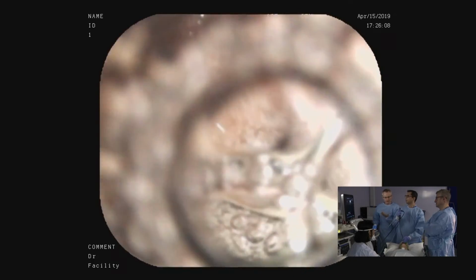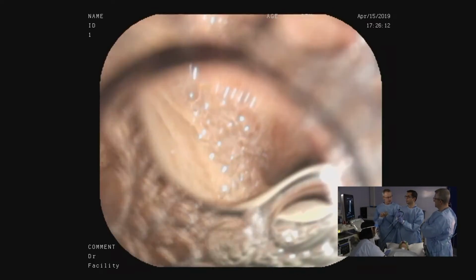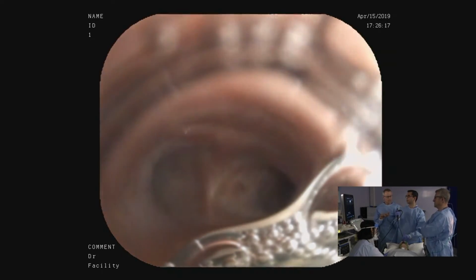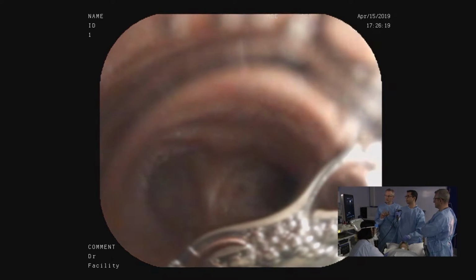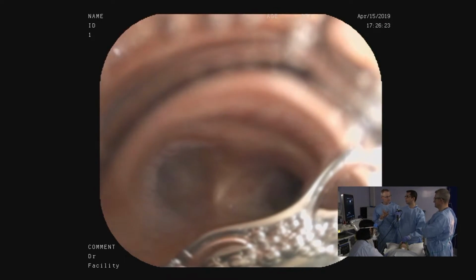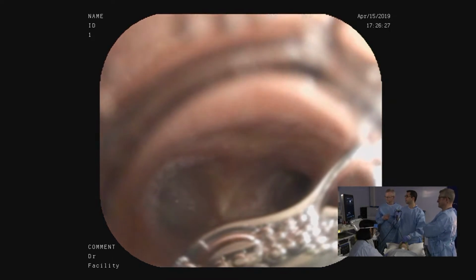Okay. So again, round morphology, heterogeneous, no central hilum, and central necrosis. Those are the 4 features. But interestingly, not size. Size, yes, absolutely. They did look at the size, but that wasn't statistically significant.